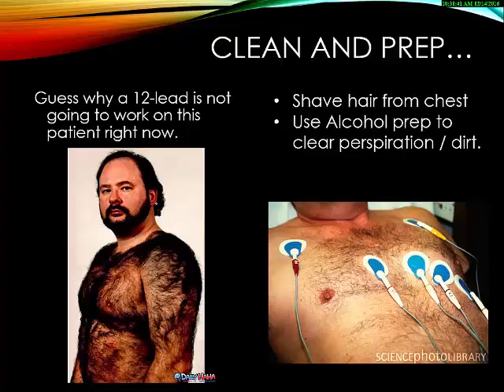And a lot of times also the patients in cardiac difficulties are going to have perspiration. They're going to be sweaty. You're going to have to wipe that off as well. If they've been working outside, it might be dirty. So you need a good, clean, hairless surface to connect your electrodes so you get the best tracing possible.